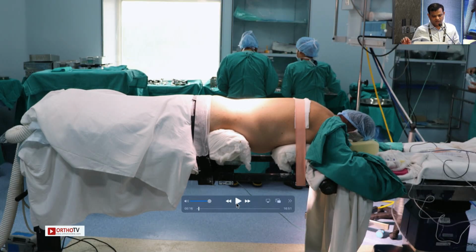Okay, so this is very important when it comes to robot positioning the patient, and securing the patient to the table is very, very important, because you can have motion errors, which is the most common error which you can get in robots. Dr. Dinesh, how do you take care of avoiding these motion errors by positioning?